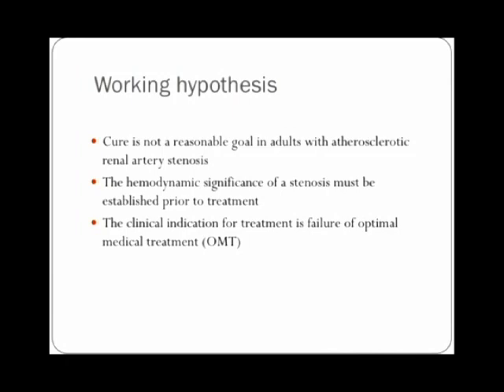If there is a linear stenosis, meaning the narrowing of the blood vessel is 75%, then that's a horrendous stenosis. It's about 90% of the circumferential area. There's really no need to put a pressure wire in or try to make a pressure determination to see if there's a pressure gradient across the stenosis. But the stenoses in question really are down around 50% and 60%. We think that a 50% linear stenosis, so the cardiologists have told us, is a 75% stenosis of the cross-sectional area, which is significant clinically if you get there.